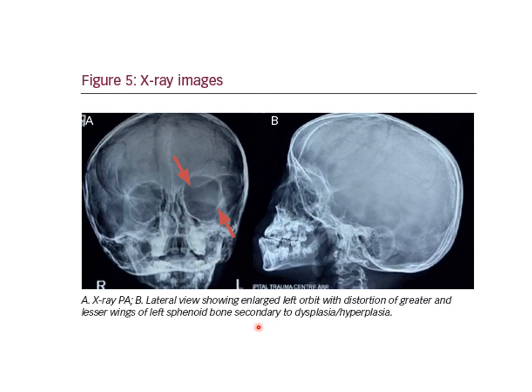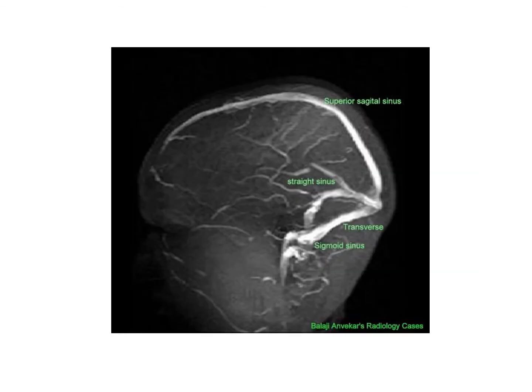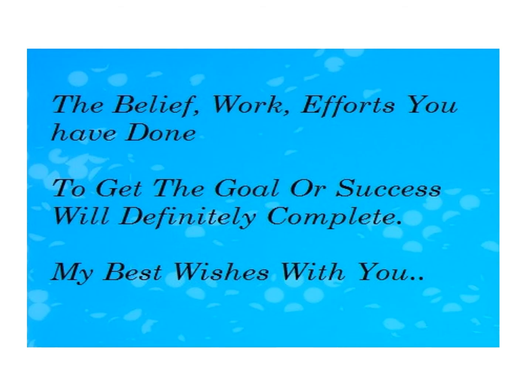A lateral view showing the left orbit with distortion of the greater and lesser wing of the left sphenoid bone — here the left orbit is enlarged, which is commonly seen in neurofibromatosis. Then in a venogram you can study the dural venous sinuses: the superior sagittal sinus, right transverse sinus, sigmoid sinus, and confluence of sinuses, though this is not commonly done nowadays.